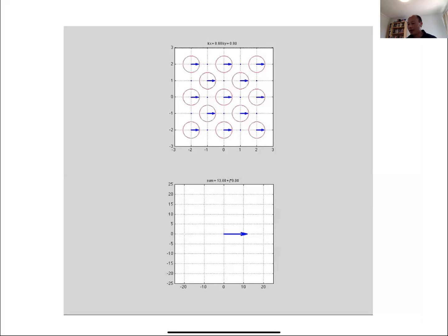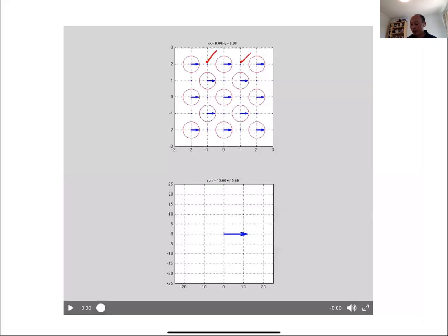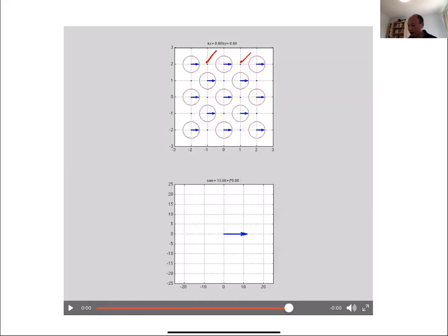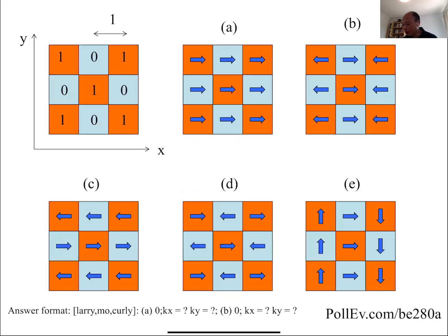Now here we have an object, like the one we just did, where all these spins here are missing, right? Okay. So if I have a uniform spatial pattern, things are still going to add up, but as I change that spatial pattern, there should also be a pattern where it matches better.